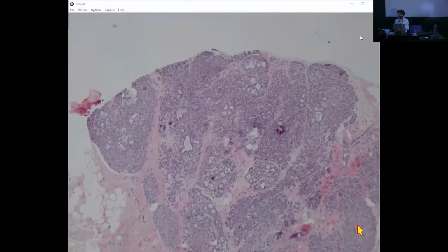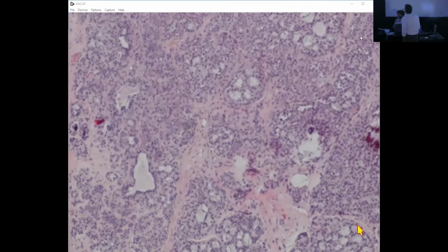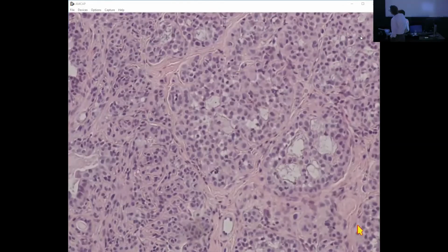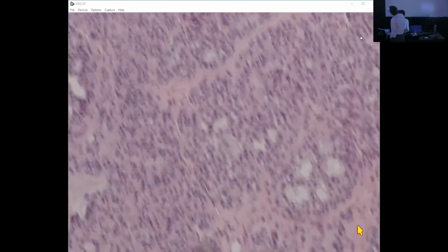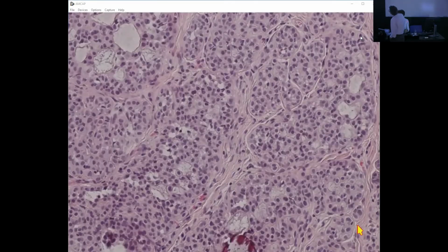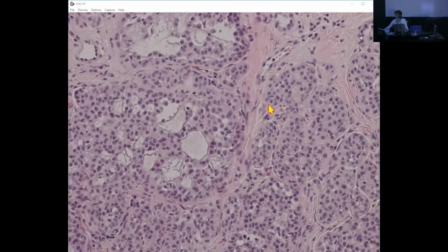Is it in focus? So this biopsy was done for calcification. And I'll give you more to see. I hope it's in focus. It looks like classic lobular carcinoma in situ in an adenosis. In adenosis? There is this entity we were discussing. Collagenous spherulosis. Excellent.